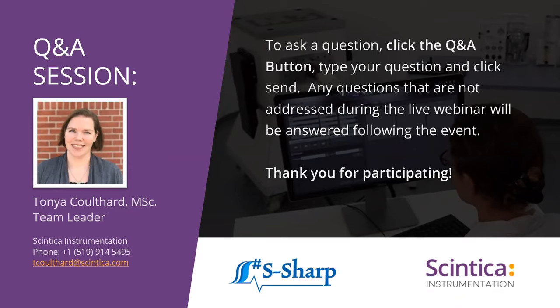For sure, that's a really great question. As I mentioned during the presentation, it is a 15-inch touchscreen display that does work with gloves, but obviously for entering labels onto images and making measurements, a keyboard and a mouse would make that significantly easier, and that of course can be added onto the tablet system itself if you'd like for use during your acquisition. And of course there's always the offline analysis package which can be used to do analysis offline on your own computer, which would of course have those peripherals attached.